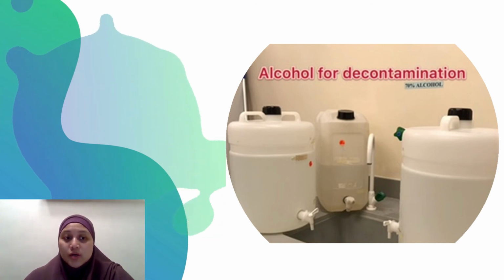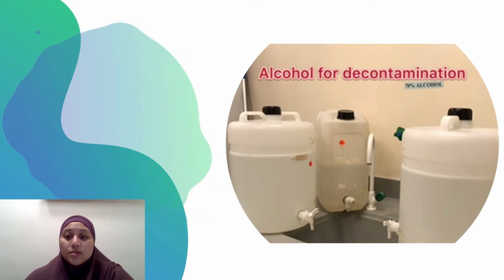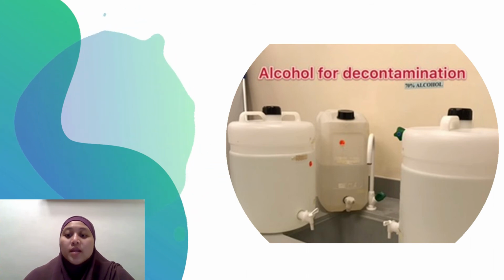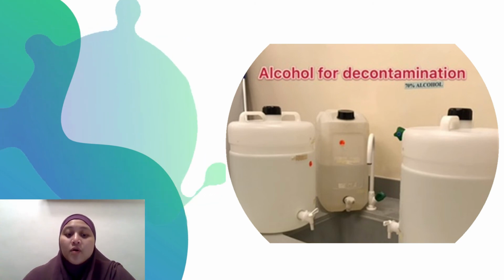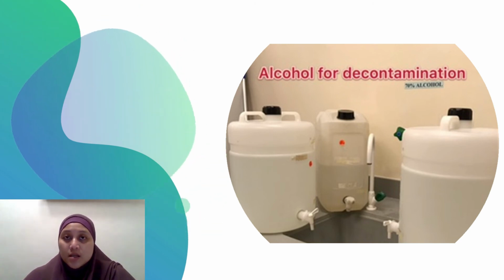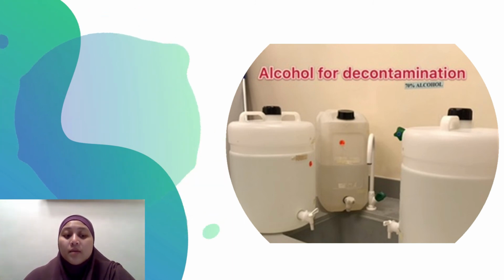The pure alcohol can denature the protein in contact in all directions. The denatured protein would then stop the alcohol from penetrating further inside the bacterial cell, and this leads to inactive but not dead microbes. When the condition permits, the microbes will be alive again and will start functioning and propagating. So when we use 70% alcohol, this concentration can still denature the protein but at a slower rate. Therefore, the penetration can occur through the cell before the coagulation or denaturation process takes place. Then, the entire cells will become denatured and cause microbial death.